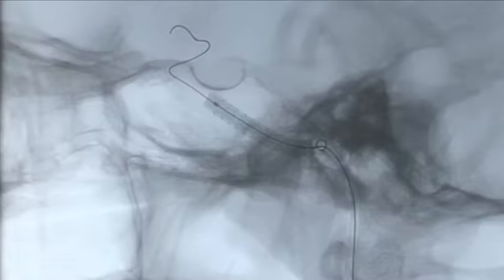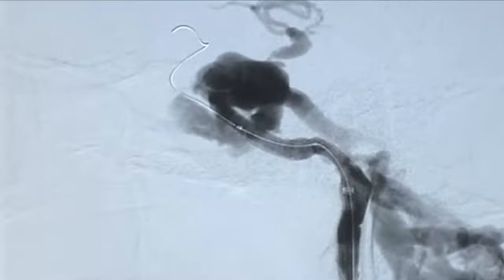And once we have done that, this is the fully opened Graftmaster over here, and this is our angiogram after the Graftmaster. We can see that the fistula has dramatically slowed down but is still filling.